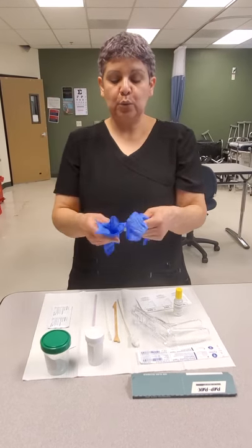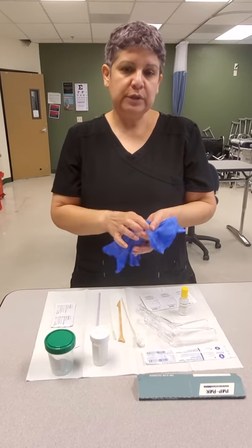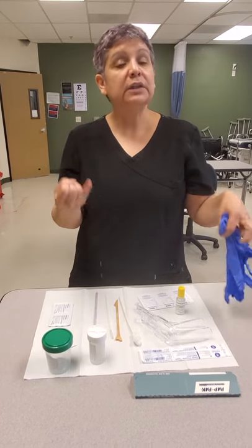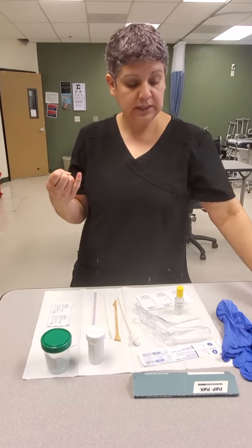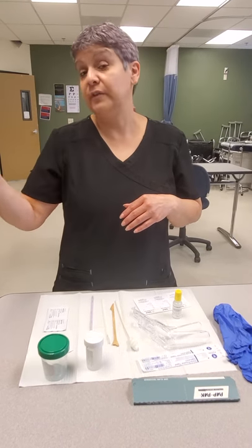The three gloves are for the provider because the provider will use two gloves on one hand and one on the other. Two gloves will be used when the provider does a rectal exam for the patient. Patients usually get rectal exams at 35, 40, or 45 years and above — it just depends on your OB-GYN.